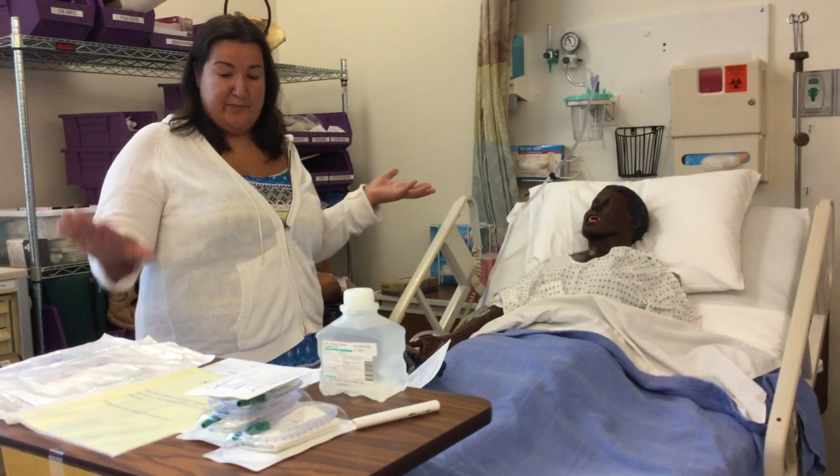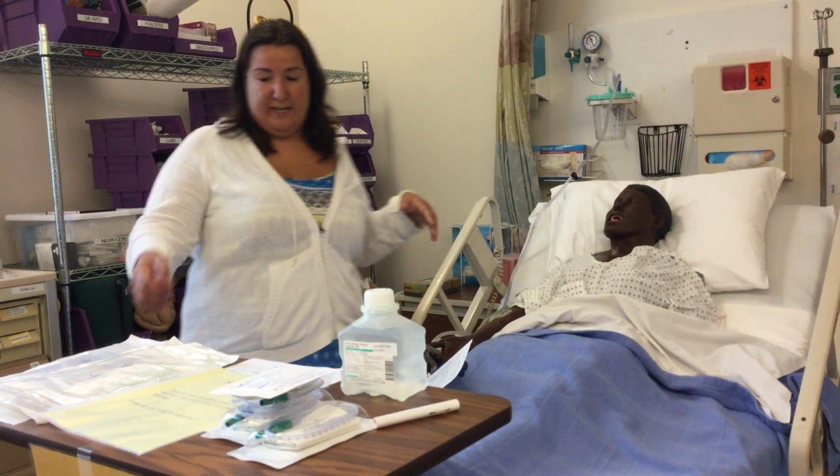You want to check for any allergies, just to make sure that they're not allergic to any of the equipment you're using.